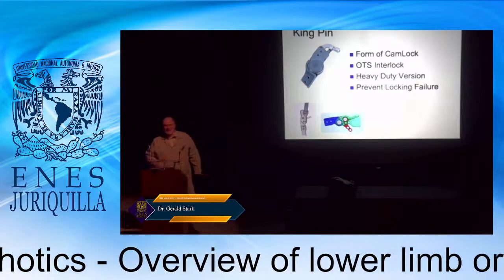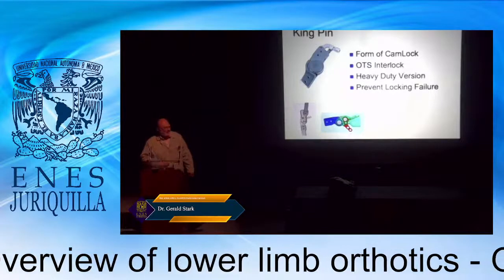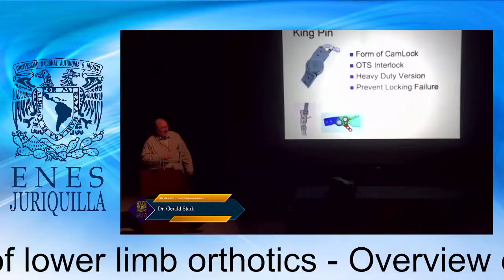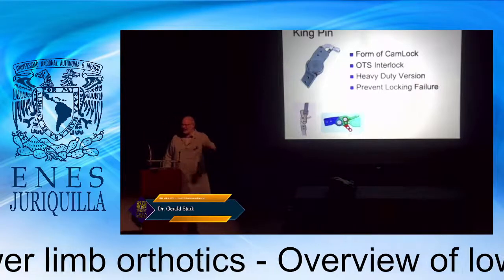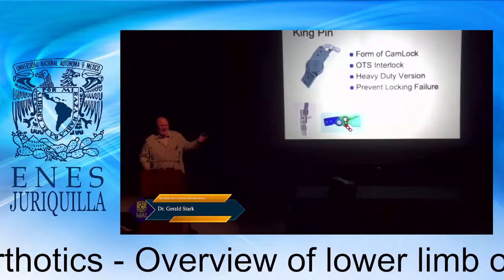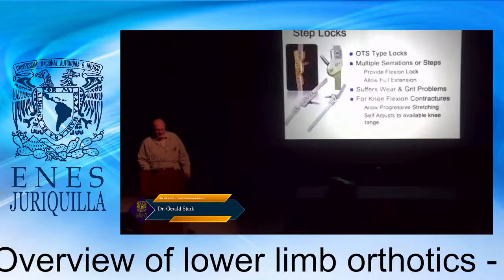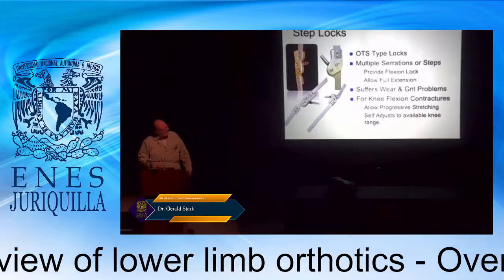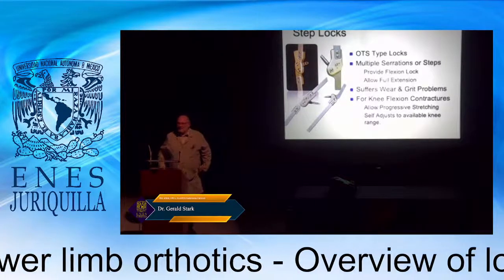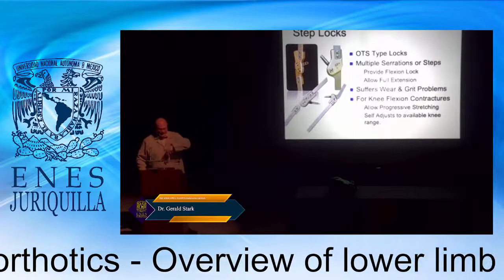In terms of engineering, this is a very difficult engineering issue because the tolerancing of the knee on both sides of your clevis, as well as the locking pin, all have to work together to allow it to lock. And over time, things begin to wear. So sometimes the patient's locks begin to break down. So the problem is there's only one point of locking. So how do we overcome this? And we overcome this with a thing called a step lock.